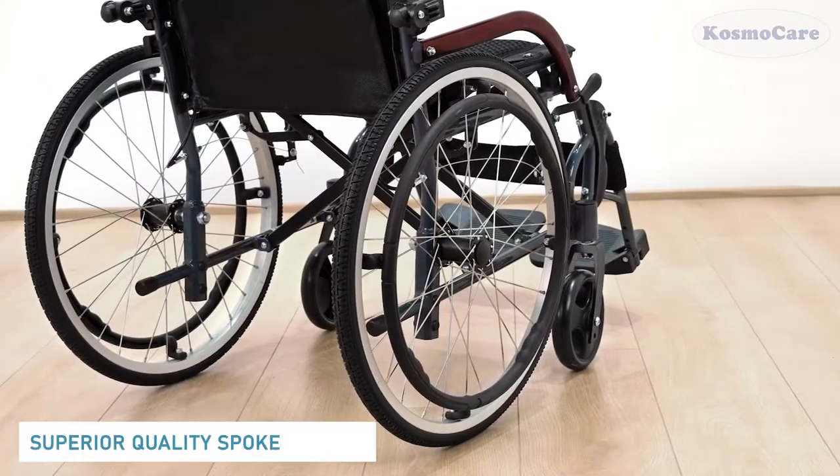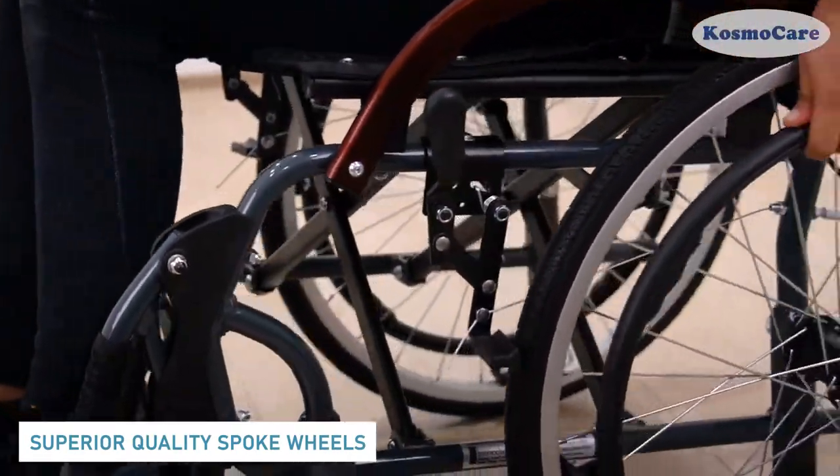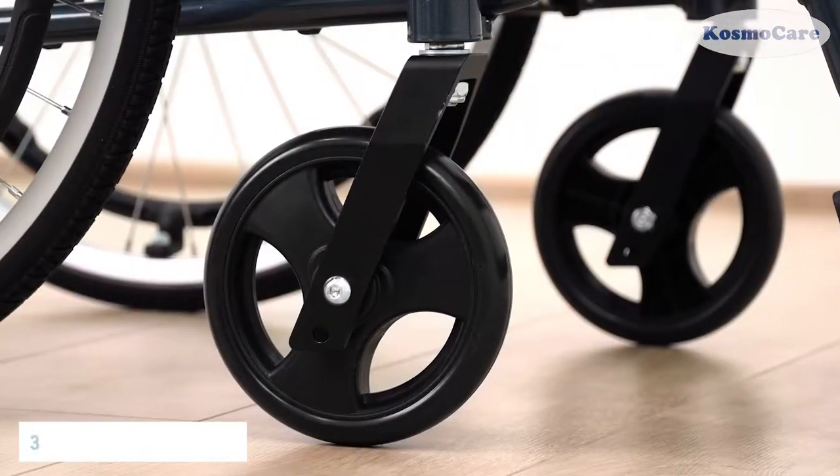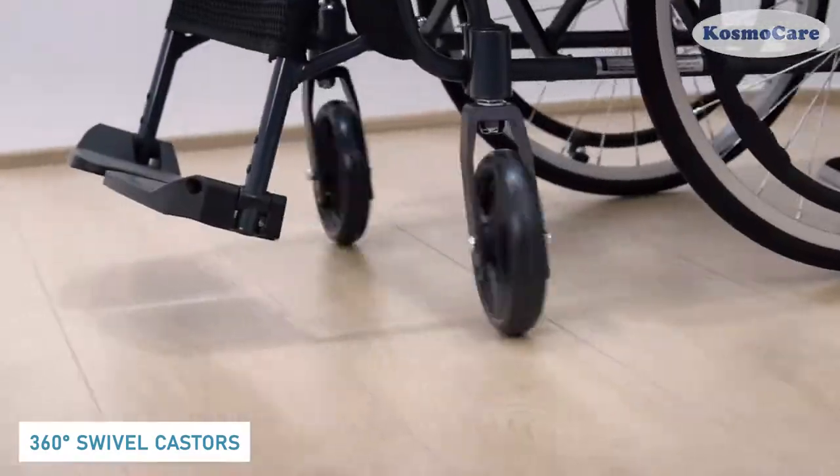The superior quality aluminum spoke wheels are low in maintenance with no air filling required. The solid PVC front casters swivel 360 degrees to maneuver the wheelchair through tight spaces.